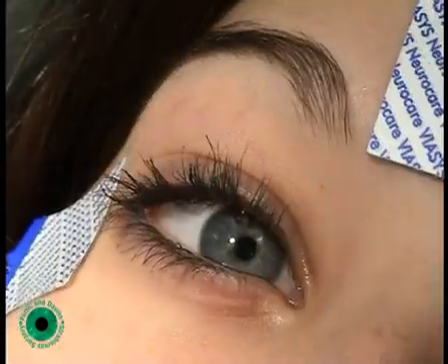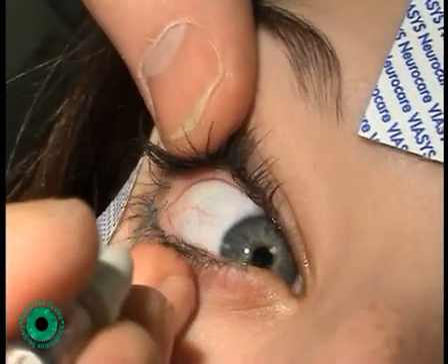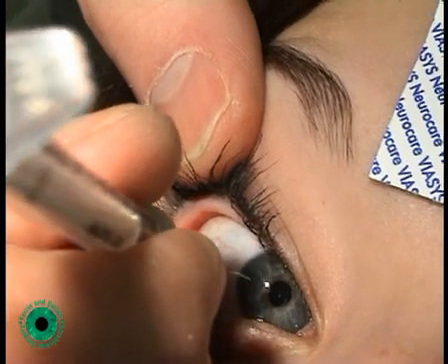The patient is then asked to look to her left, and the needle is held in such a way that the bevel is pointing against the surface of the conjunctiva, and it is then advanced through the conjunctiva.